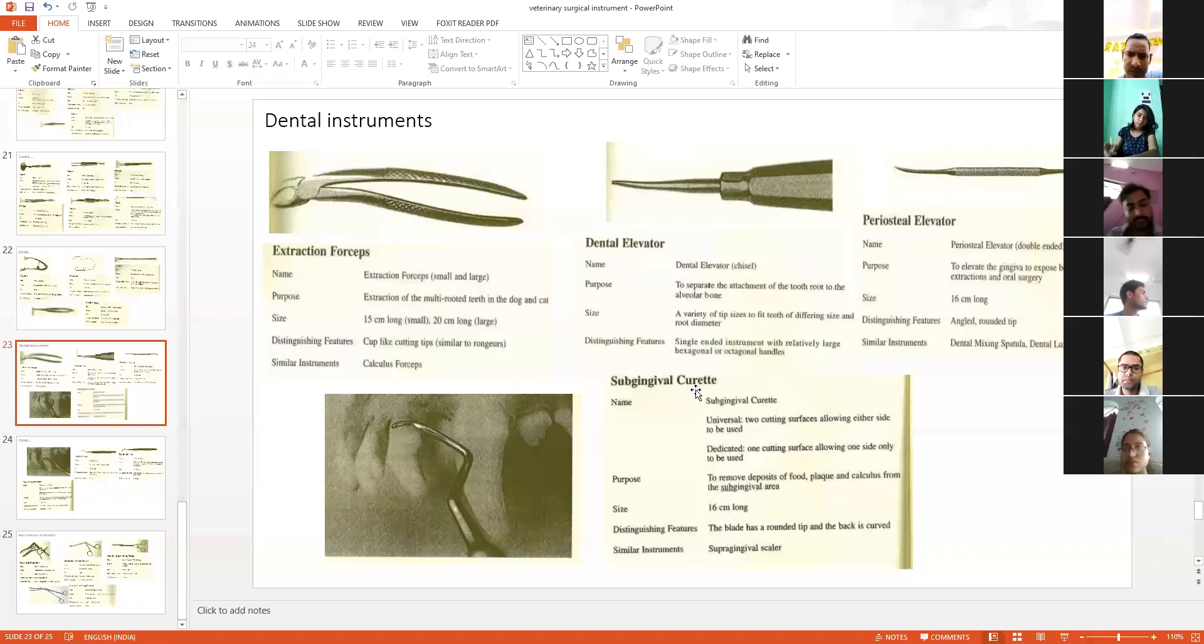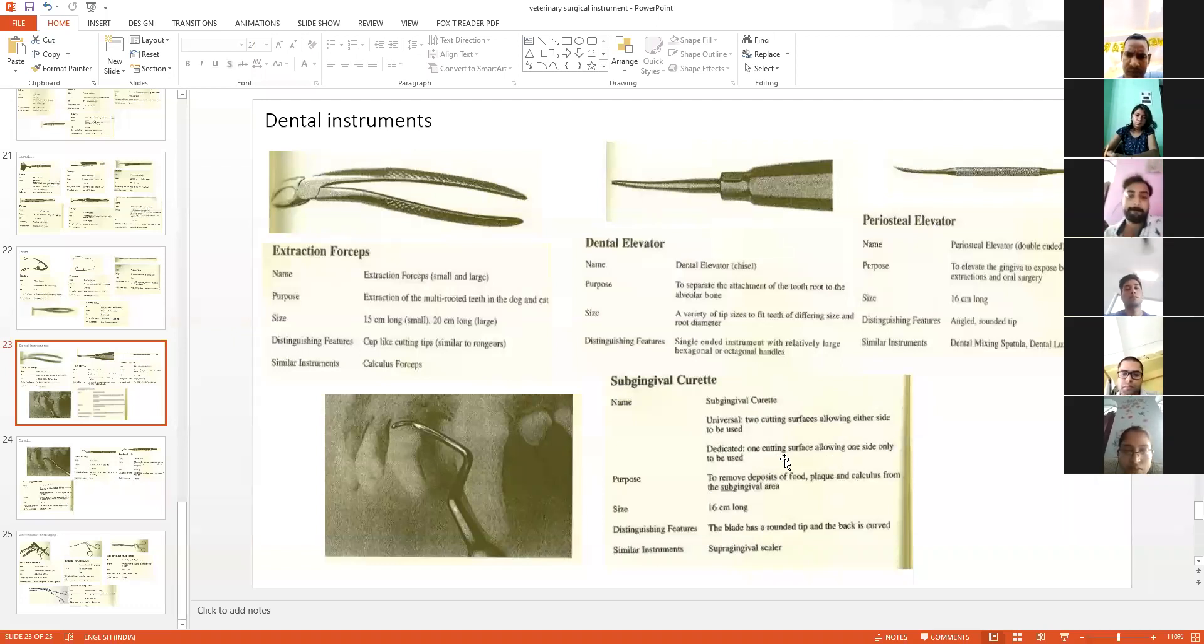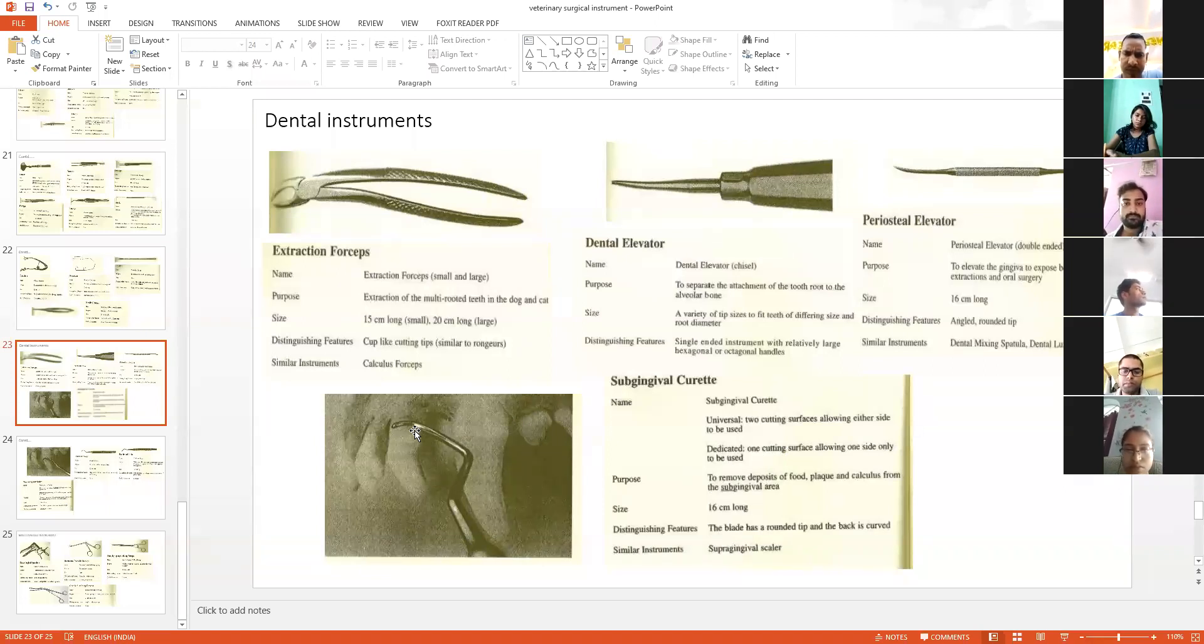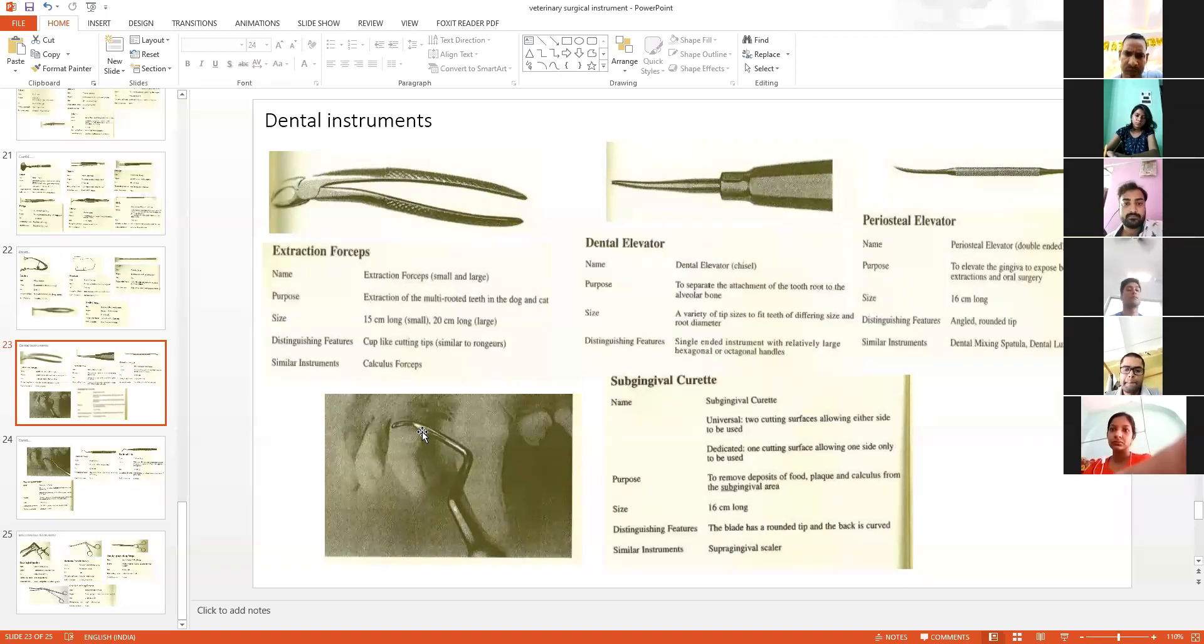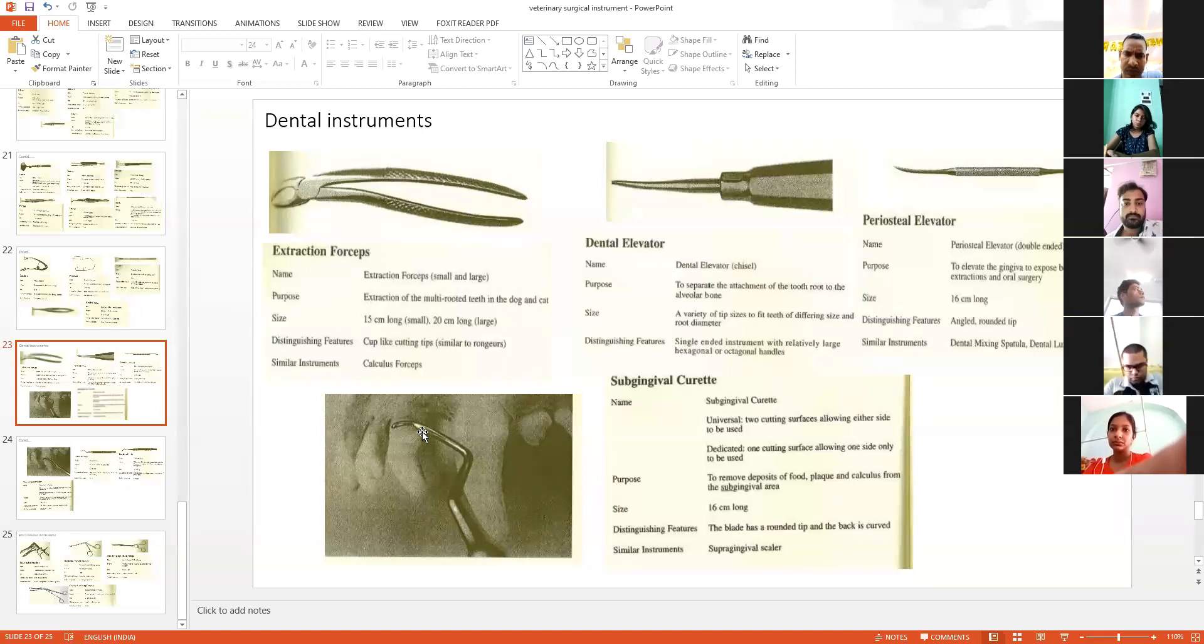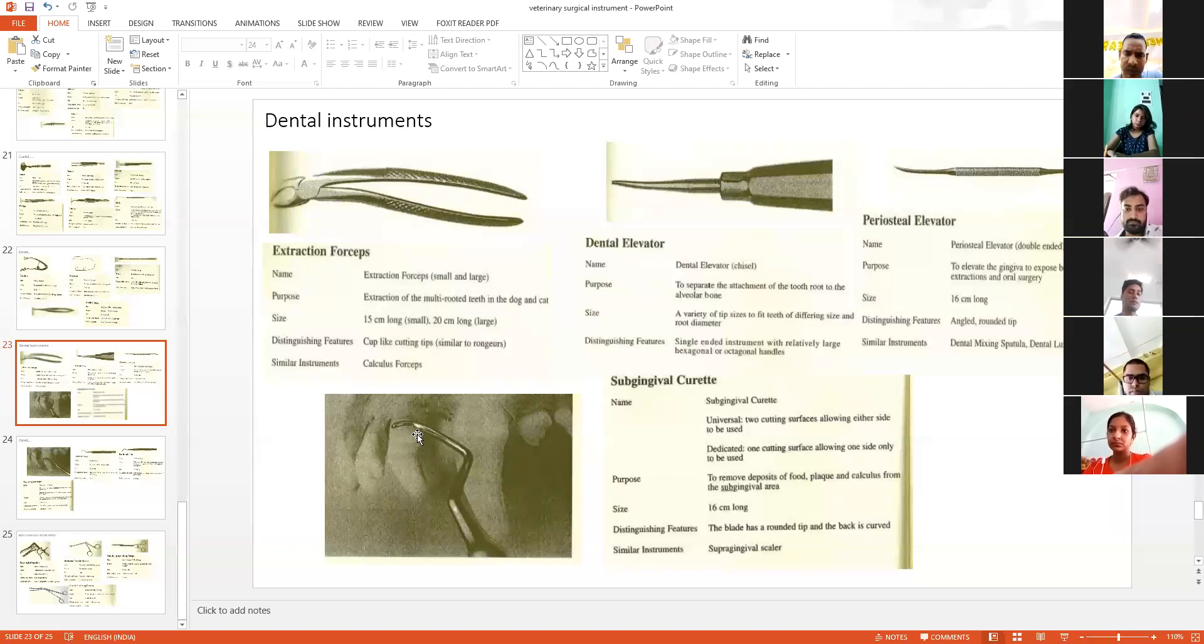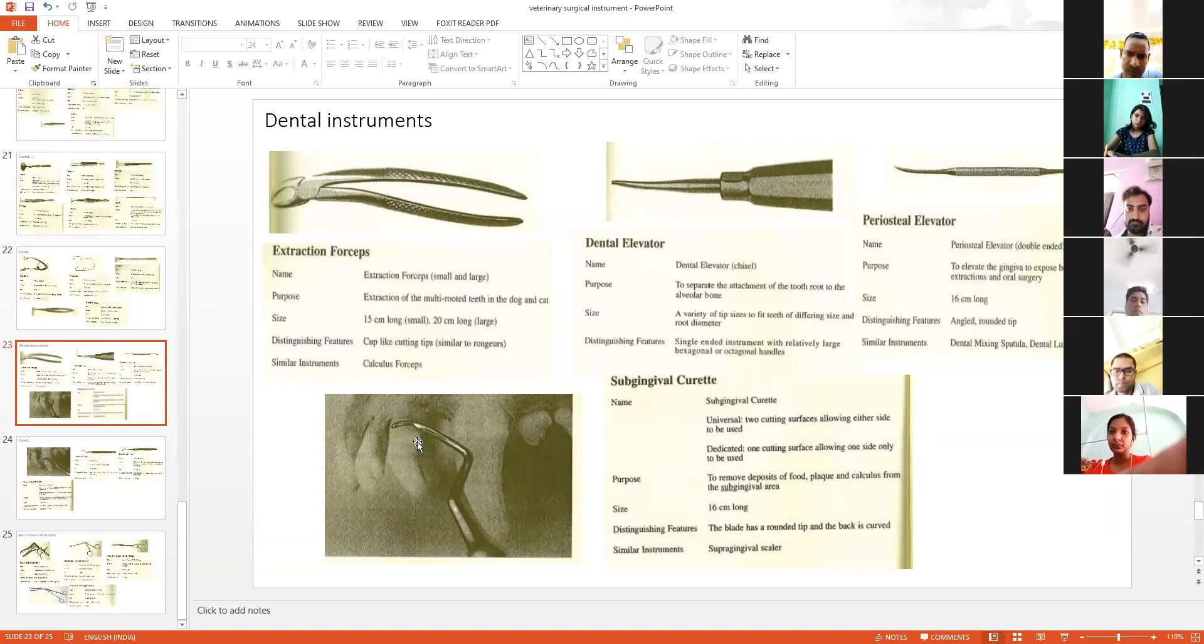This is the sub-gingival curet, which has one cutting surface. One portion has a cutting edge. When there is tartar deposition, food deposits, plaque, or calculus, you can use the cutting edge of this curet to clean the teeth and remove the tartar deposited over them.